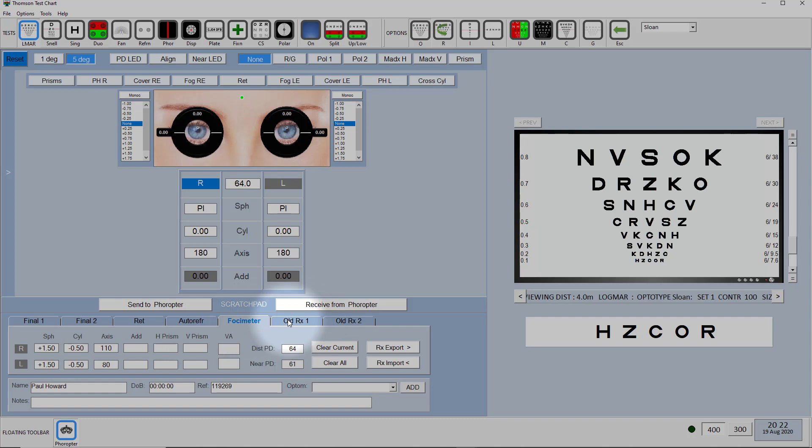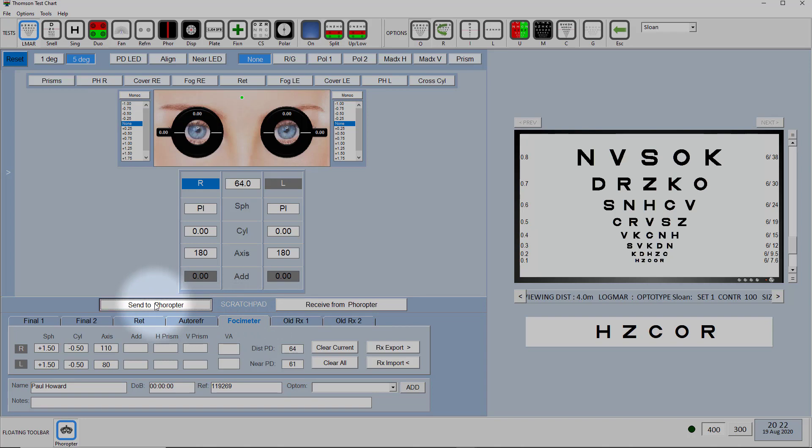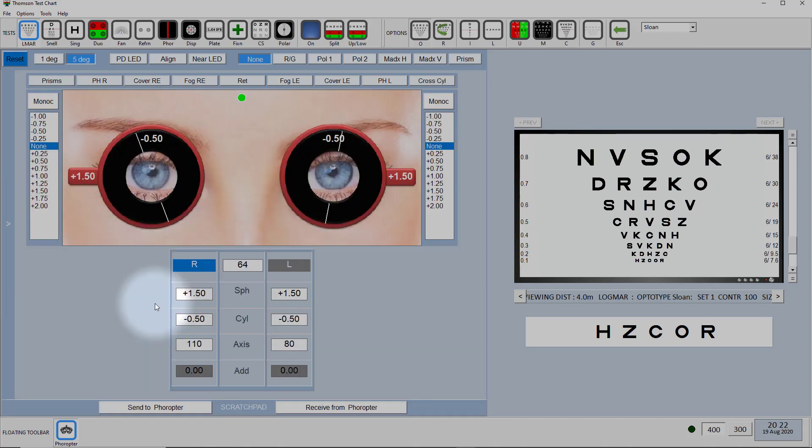In this particular case it's read in two prescriptions, one under old RX 1 and another one under phoropter. Now the beauty of this is you can then send that prescription straight to the Phoropter by clicking on send to Phoropter and that old prescription now is automatically put into the Phoropter with the correct PD.